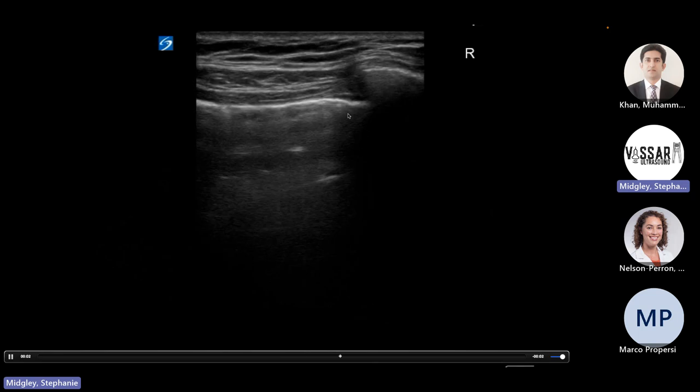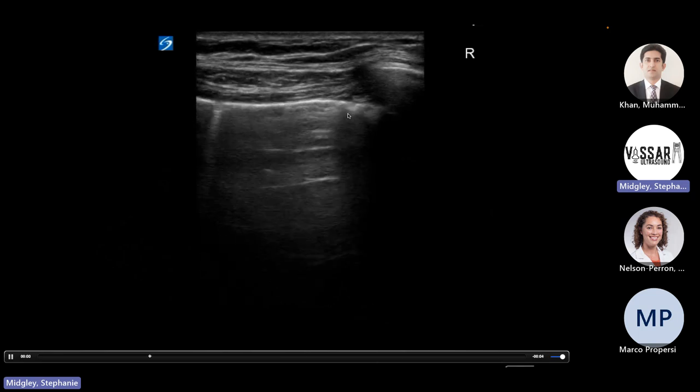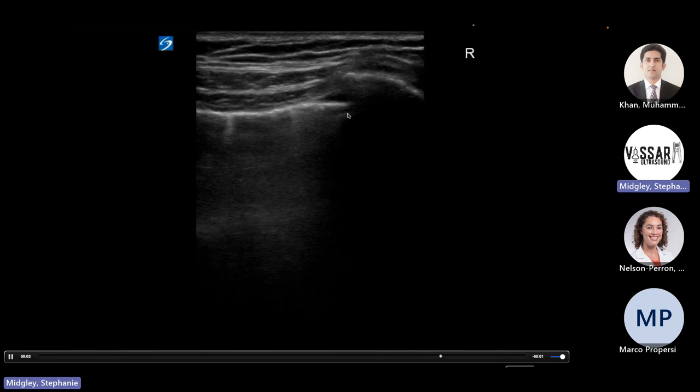So again, okay, nice, thanks. Good lung sliding. Yeah, of course. If anyone else has questions, just unmute because I can't see the chat and I can't see anybody's face.